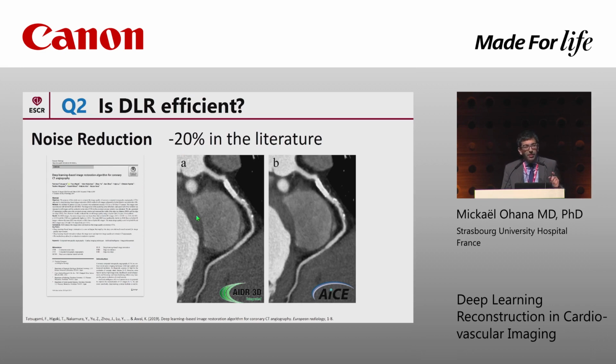Yeah, but remember that this was done on the training data set, where the dose initially was higher because they wanted to get these noiseless images. So already, even with IR, the noise is very, very low. So probably what you gain is less than what you will gain in real life.